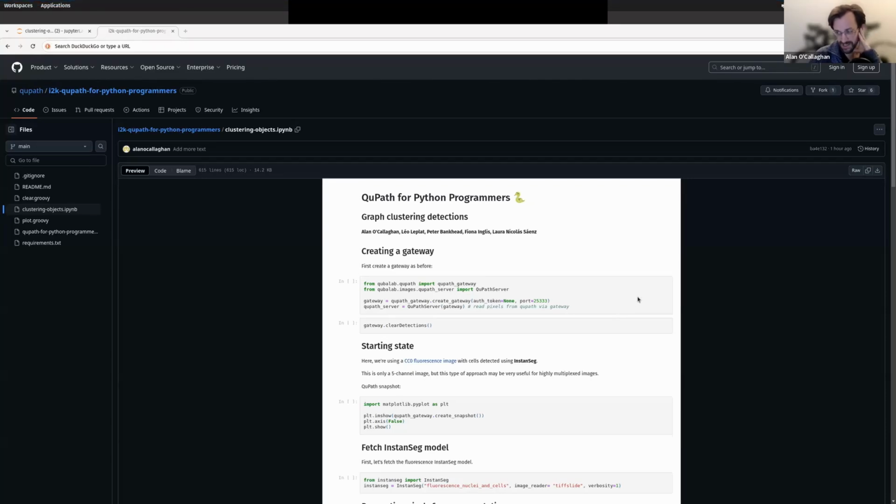Position of tiles maybe sounds like an object thing. Object thing is a bit vague. It might be best using QuPath objects like annotations or tiles or something similar. But definitely sounds like it would be easier than writing to a text file and reading back.